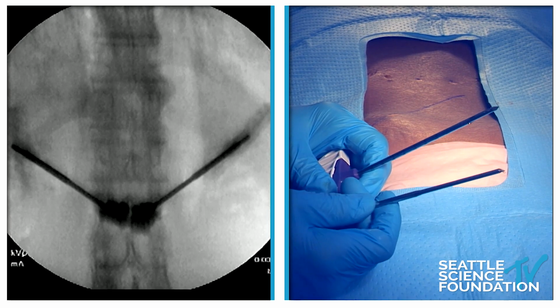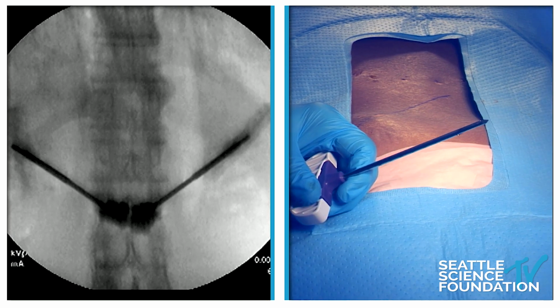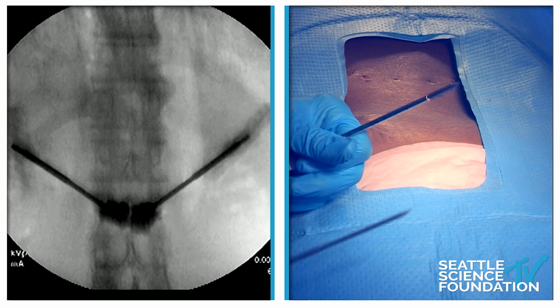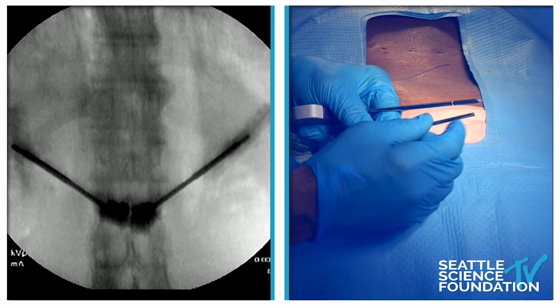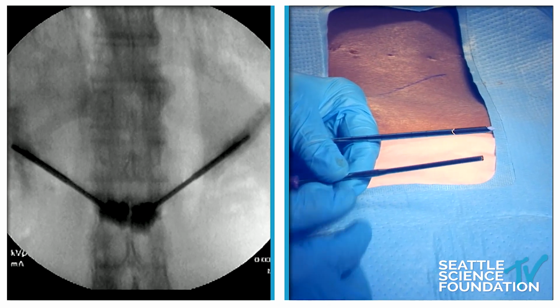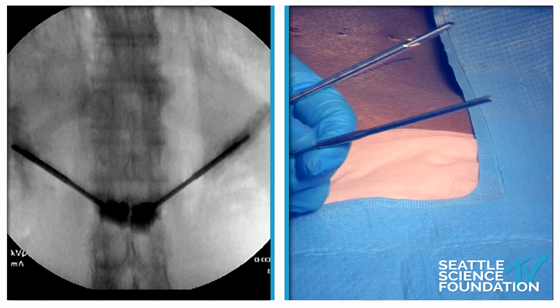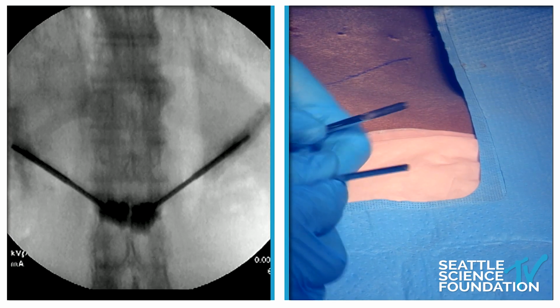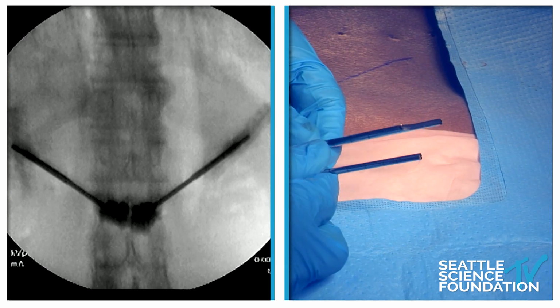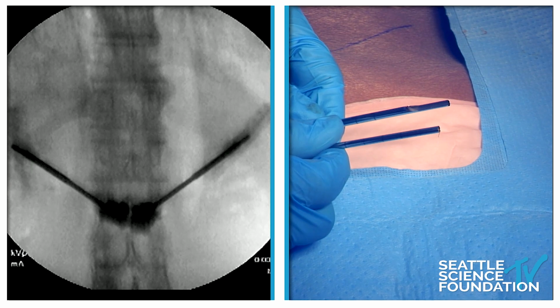As I explained earlier, this is a single bevel, a point with one bevel. If we pull this out as an example, a conventional needle, the cannula is blunt on the end. If we pull the other one out and remove the stylet, this is also blunt, but it has half of the cannula carved away.